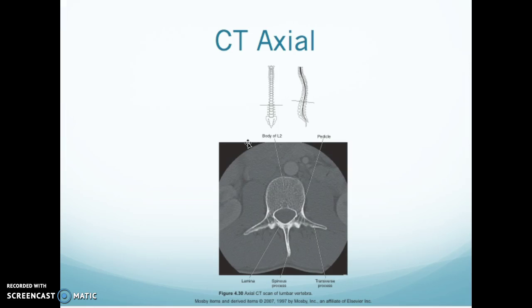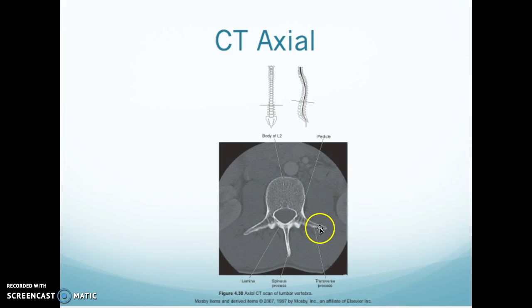Here's a CT axial. You have the body of L2 — you know that because if you count on the little display you can see that you're at L2. You have your body, your pedicle, your transverse process with your lamina, and your spinous process.